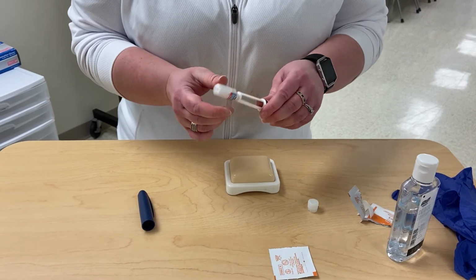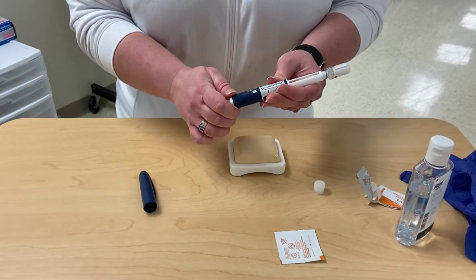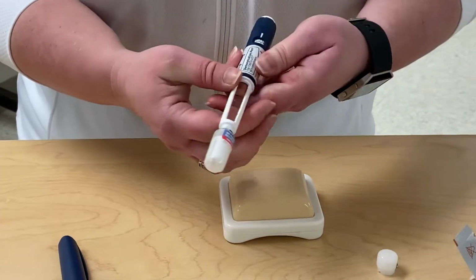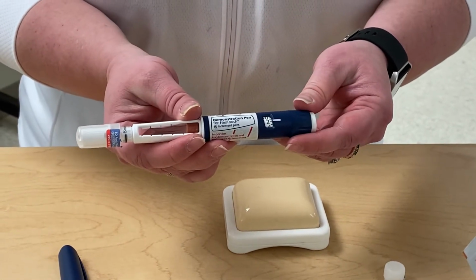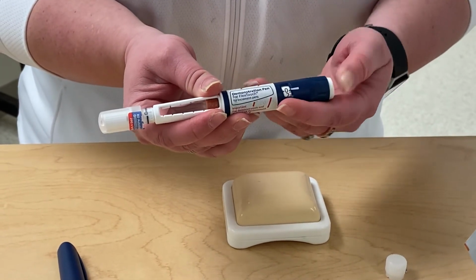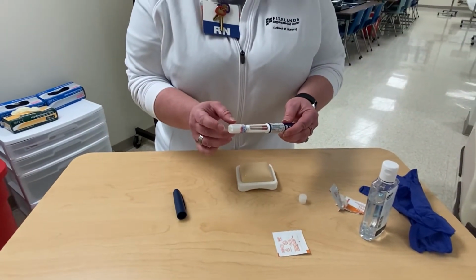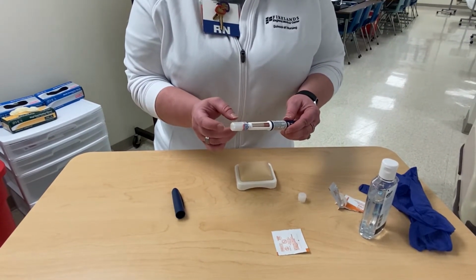Okay, to prime the needle, turn the dial to 2 units of insulin, and then press the plunger down to release the insulin. You'll actually, at the end of this, see drops of insulin in your cap.